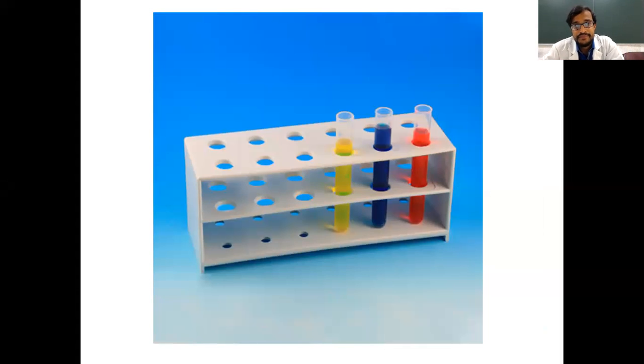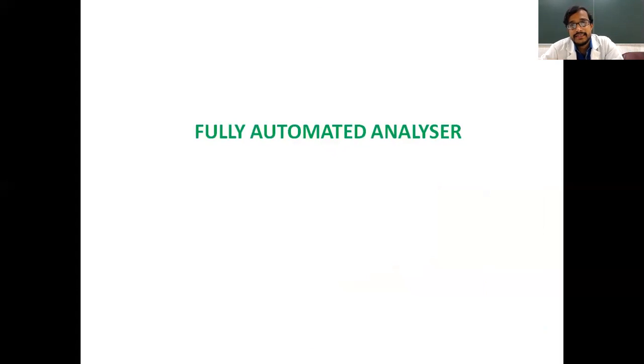And coming to the fully auto analyzer. In a fully auto analyzer, all the things are done by the machine only. Even for a semi-auto analyzer, if 200 or 300 samples come to a lab, it can't be managed by a single semi-auto analyzer. The manpower should be more. So that's why a still more advanced version of analyzer is the fully auto analyzer.